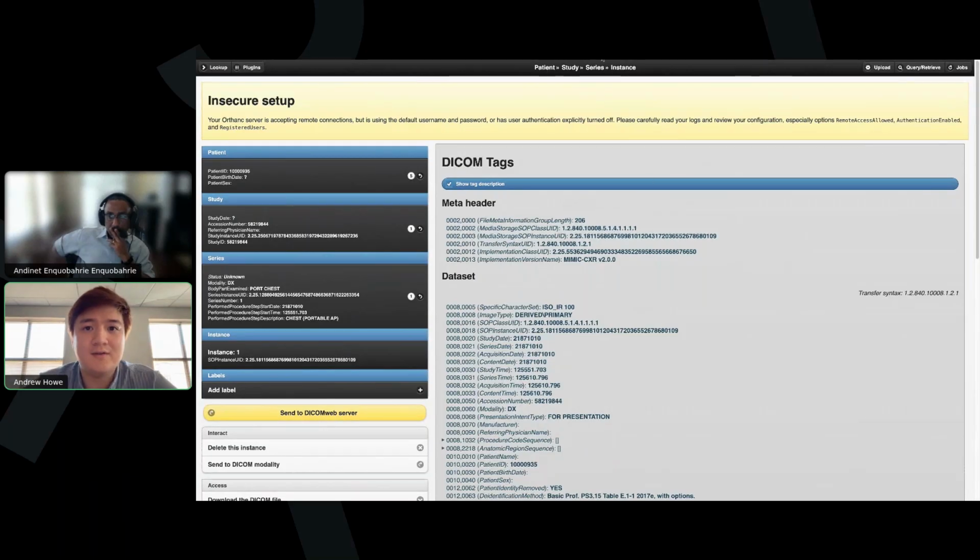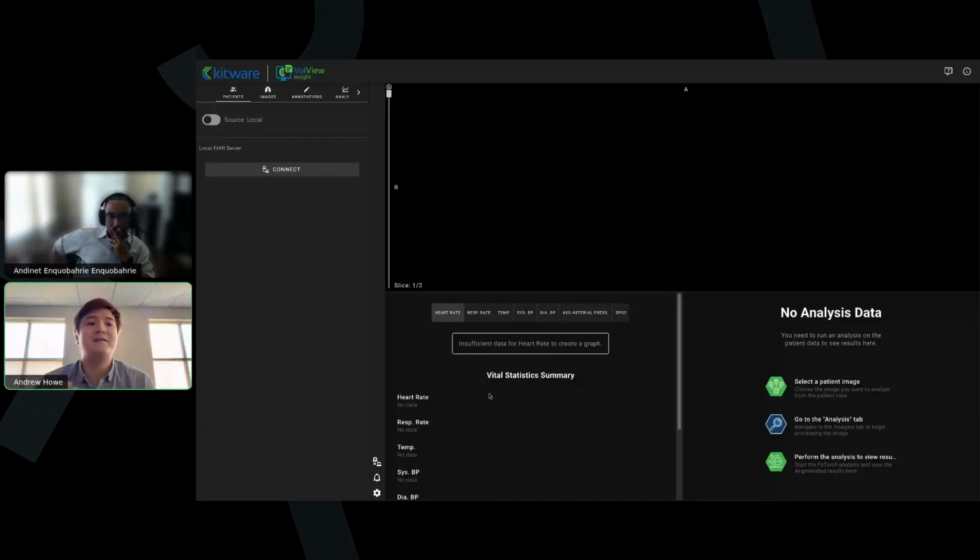And now I want to show VolView Insight. So you can basically think of VolView Insight as the physician or researcher facing glue that takes in the images from the PACS and takes the EHR data and it mimics a clinical deployment. By mimics, I mean it actually implements the constraints that you would have to face if you're creating an app that's intended to work with an EHR.